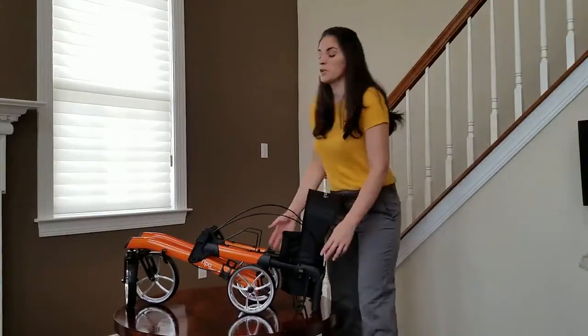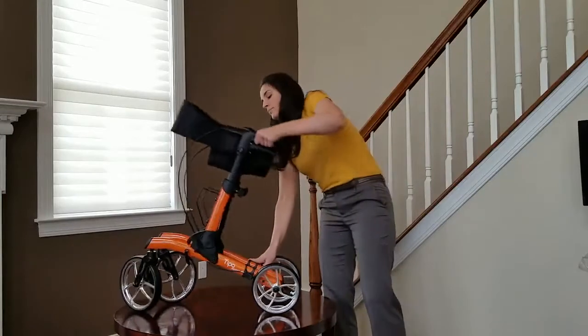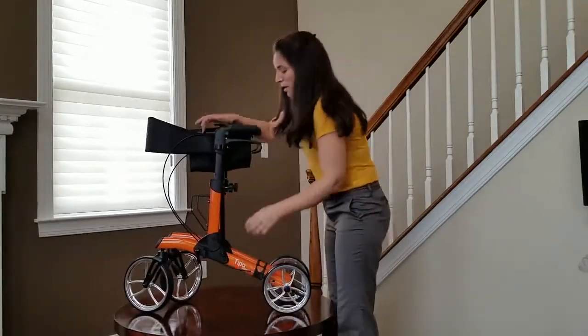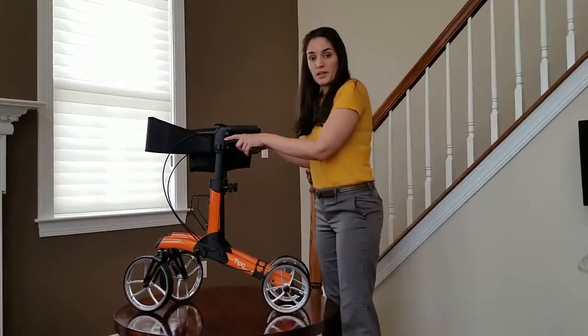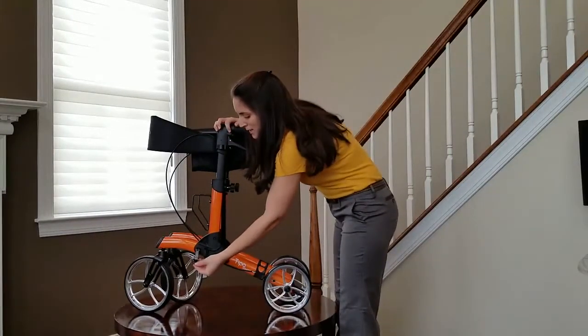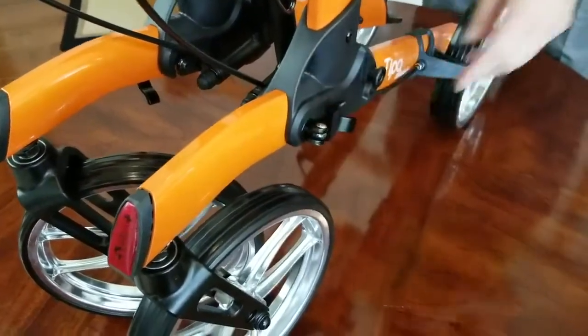The first thing you do is bring the handles up on your walker. Do that until you hear a little clicking sound, and then make sure that you lock the brakes. Now, find this metal lever, bring it up, and slide it down on both sides.